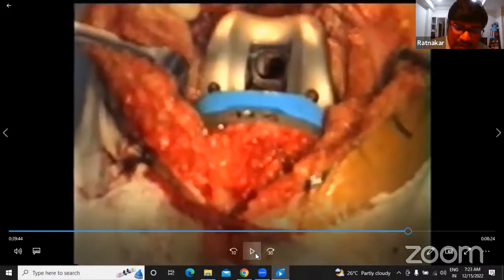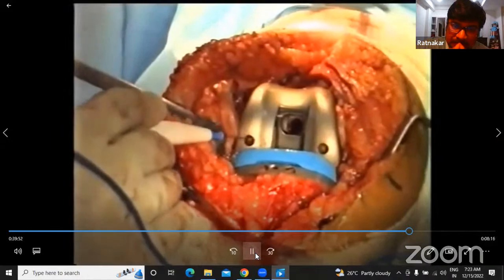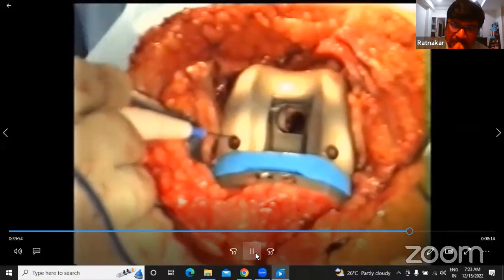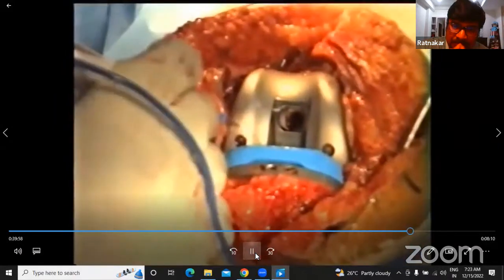Now, we have 10 commandments. This will be again explained by the master in the next session. It should track nicely on both sides. But when I do the flexion, this condyle should lift off equally as this condyle. There should not be any lift off unevenly.